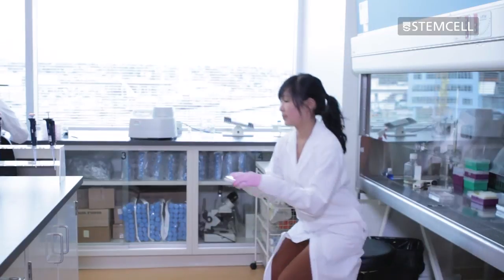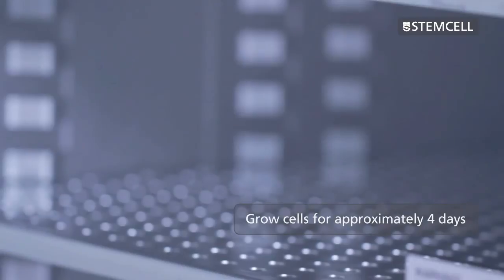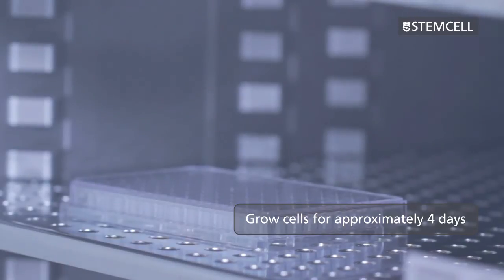Ensure a new sterile pipette tip is used for each well. Grow cells for approximately four days and then screen for specific protein products using appropriate screening assays.